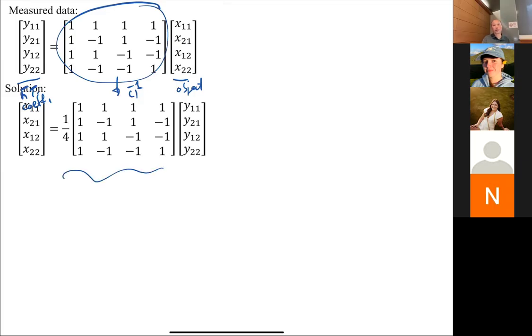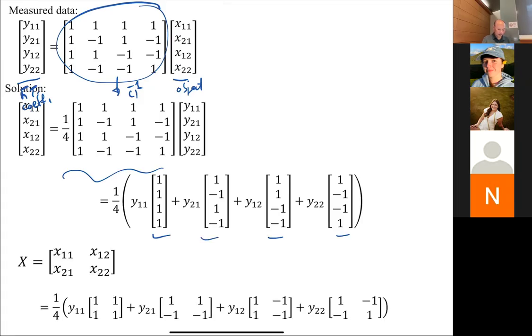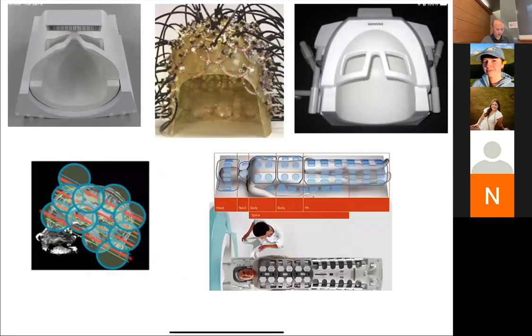And then you just solve like you would. And then you can write the equation as a sum of these vectors. And if you wanted to, you could always rewrite it, going from vectors back to 2D images, and you're back to the Fourier interpretation. So we're just going into this matrix space to help with the intuition.